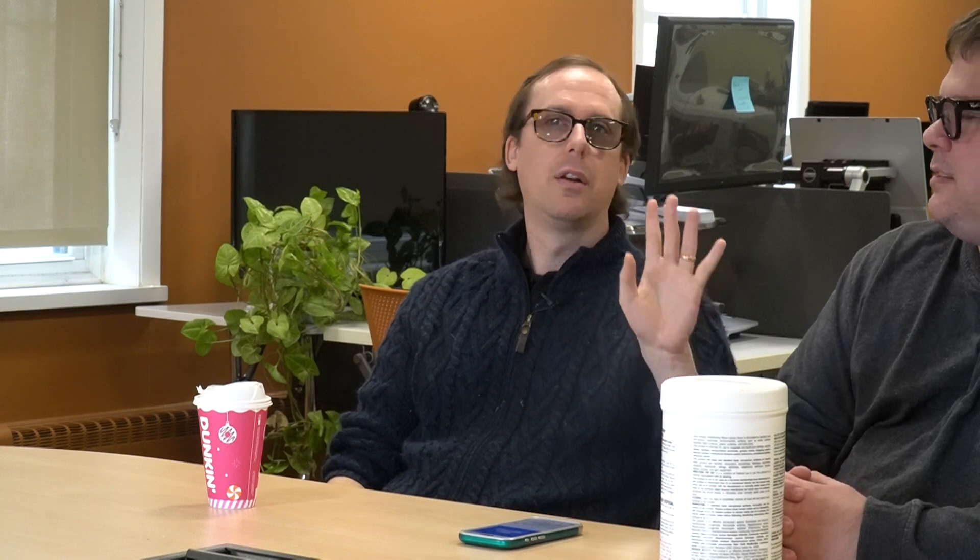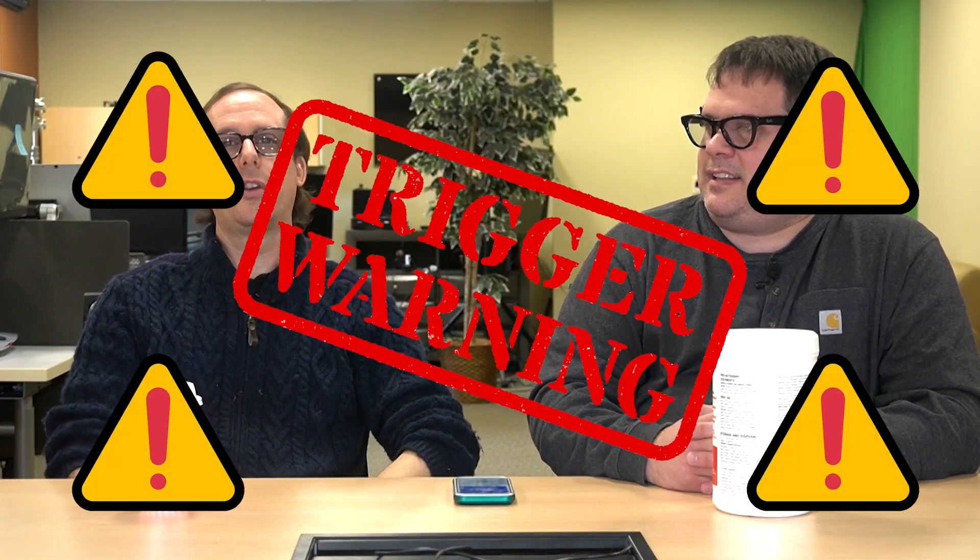So we are going to go ahead and use our trigger phrase here and connect to Be My Eyes. All right, here we go. Hey Meta, Be My Eyes. Calling a volunteer on Be My Eyes. It's opened up the Be My Eyes app on my phone, using your glasses camera, and it's now connecting with a Be My Eyes volunteer.